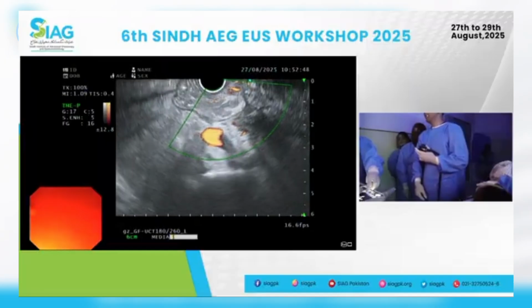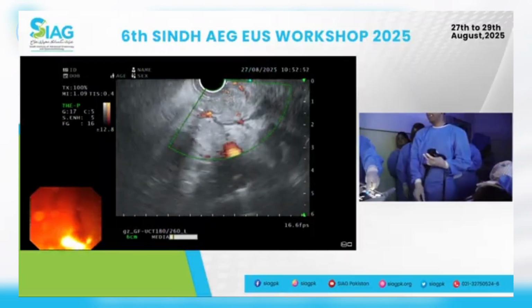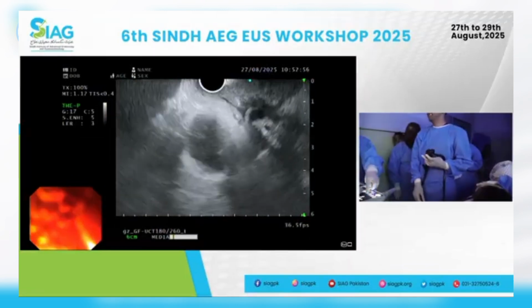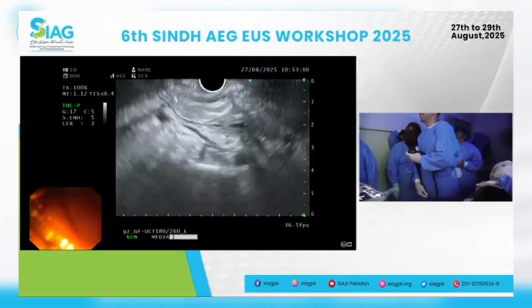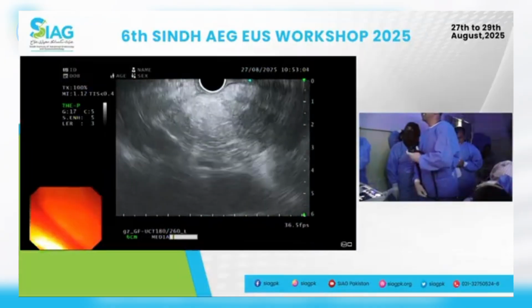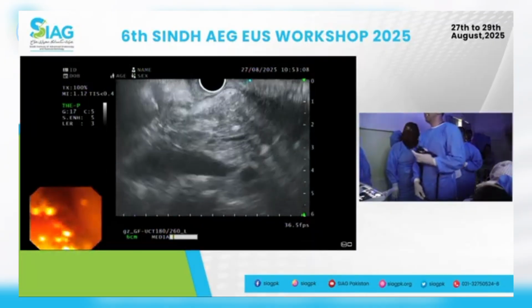I know this is IVC. Good. And the aorta seems compressed. This is the right kidney there. That's it. Get rid of it. I'm pretty sure this is the uncinate process, but what we want to do is bring it back and see the mesenteric vessels so that we can convince ourselves.